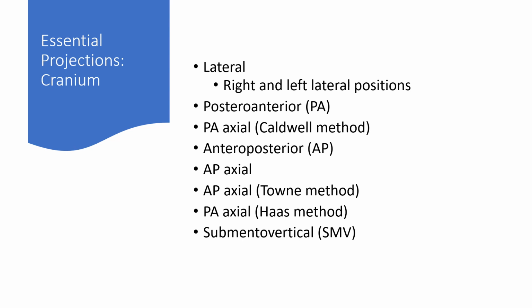All right, so what projections are we talking about for the skull? Lateral, both left and right, are routine positions.